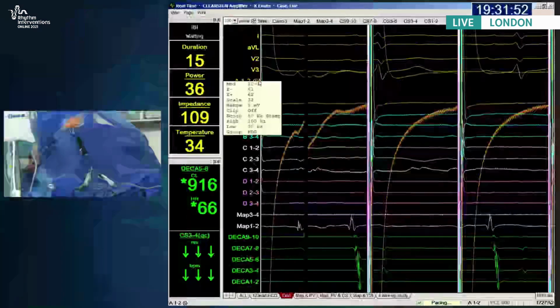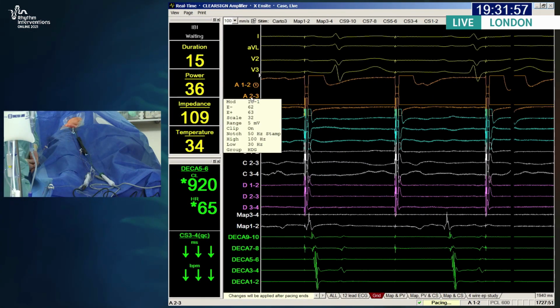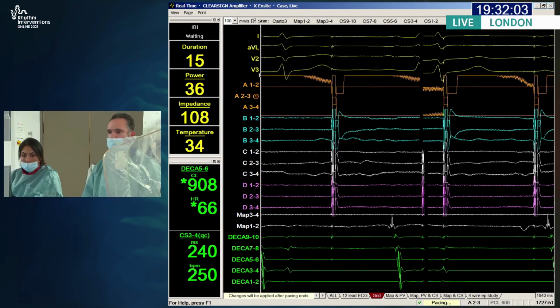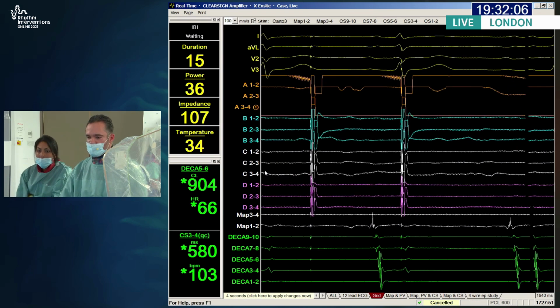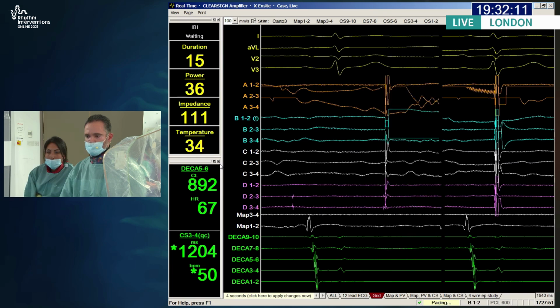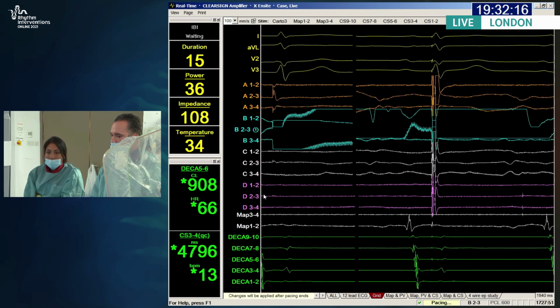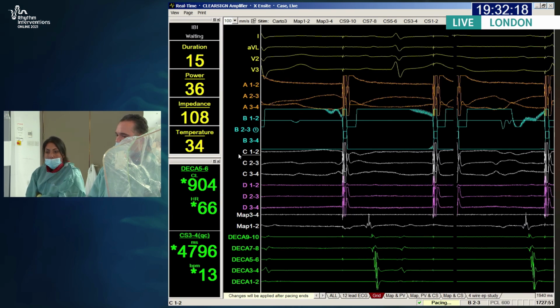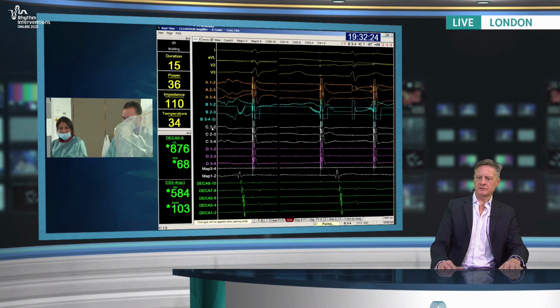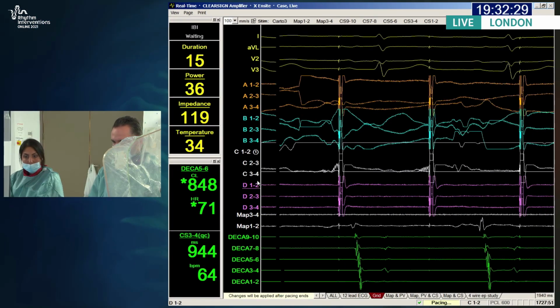I think showing capture of the pulmonary vein sleeves is really great if you haven't seen the veins go or if you're in any doubt. But where we've been lucky enough to see them go first pass isolation on both sides, I think we'd be very unlucky if this weren't isolated, if it looked quiet. We are pacing around it now. Are you guys getting to see the live screen there? The live electrogram screen, sorry? Yeah. Okay. And is that local capture or is that just artifact? I'm not sure. I was betting artifact, but it could be.